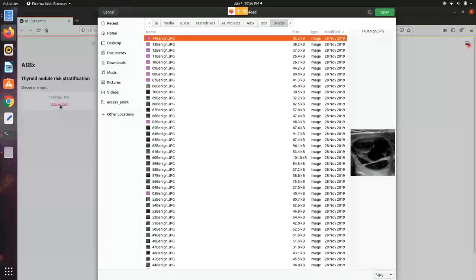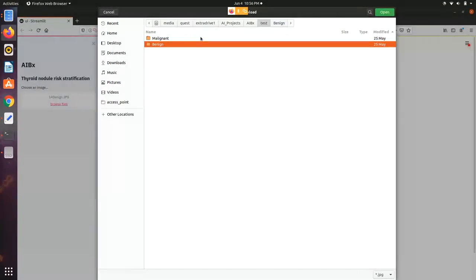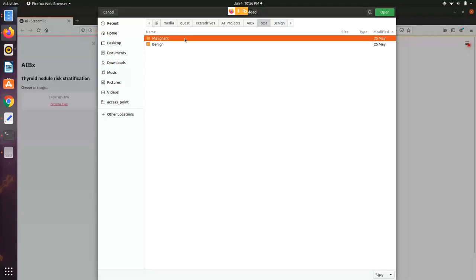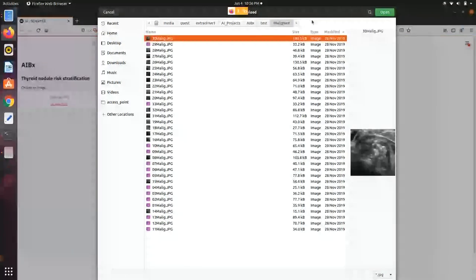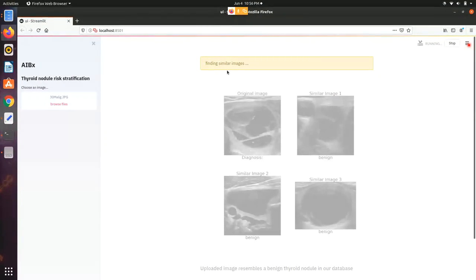Let's try a malignant nodule. I'm going to pick that first one. Give it some time, it's finding the similar images.